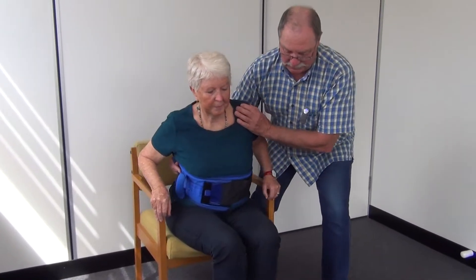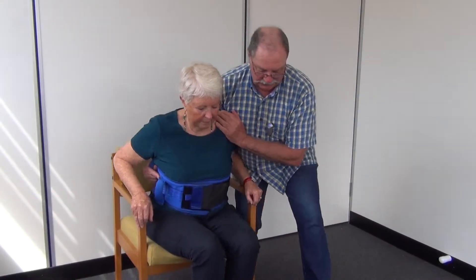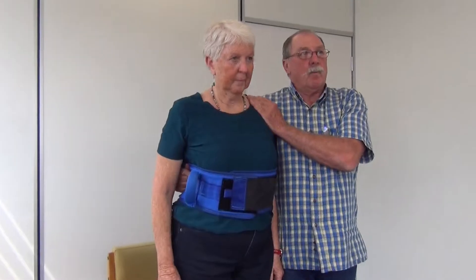Hands on the armrest, nose over toes, and one, two and three — stand up. Wait a moment.